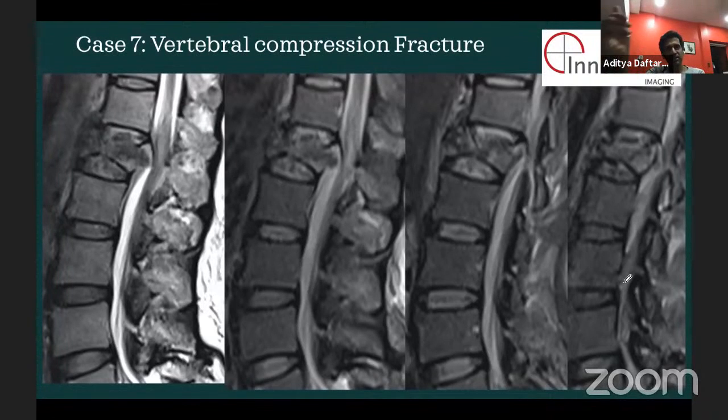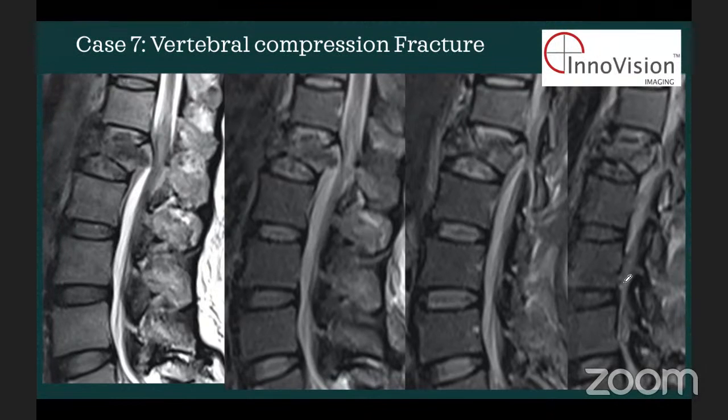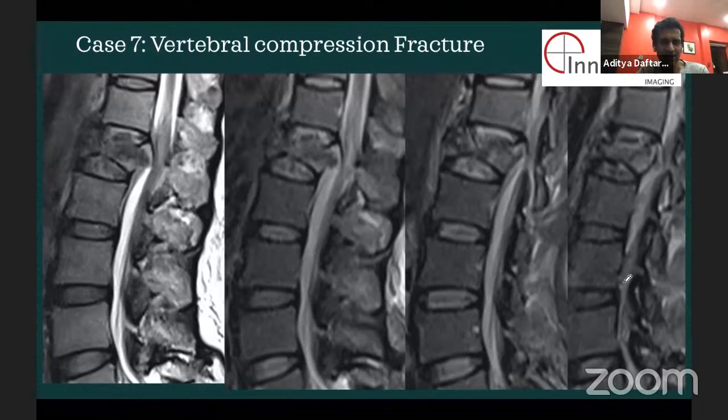So let's just say, for example, you have a post-op patient who has pain, but the pain is not bad. And so you say, this could just be post-op pain, depending on the level, I'm not going to do anything about it. Then there's no point in rescanning the patient at that stage.